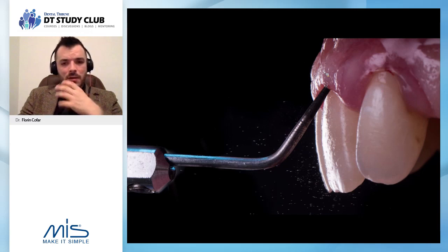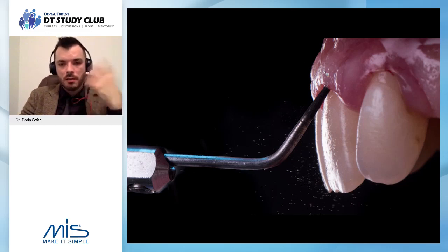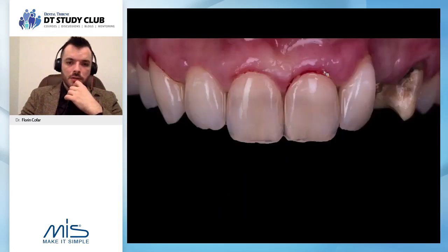The nice thing about it is that it is flat, which means you can reduce your bone very nicely without damaging tissue or the tooth, which is different than the other diamond tips, which have a coarse surface and you get a completely different effect. And we check the biologic width, and we have a tissue reduction based on our design.